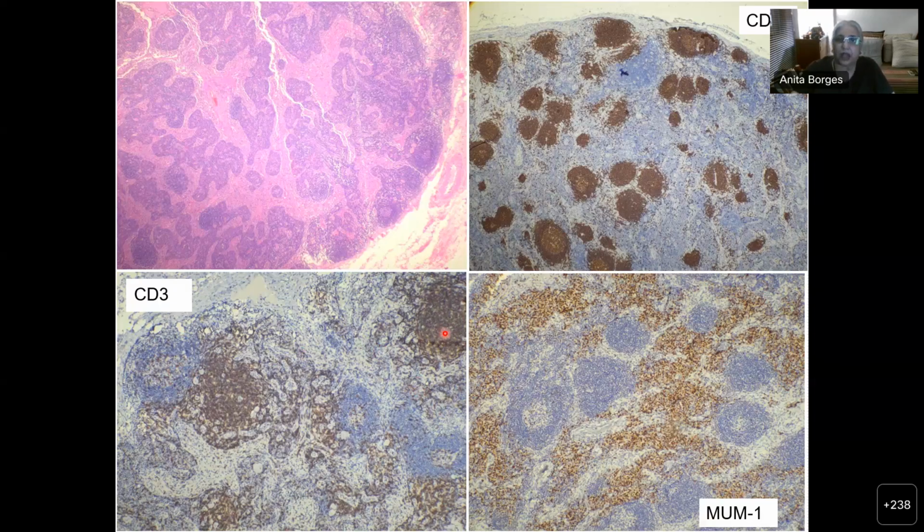So now I hope you have understood that this is a little cortex, and that is the paracortex, and it is not this broad area, though it can be very broad, and I will show you what this actually is. Now on the right hand side is MUM1.